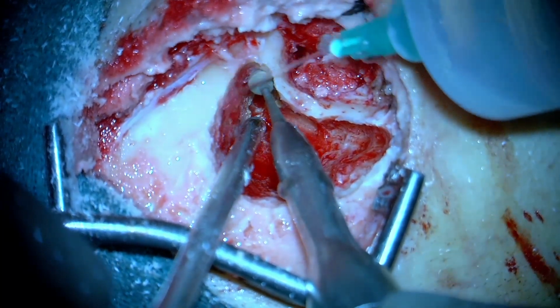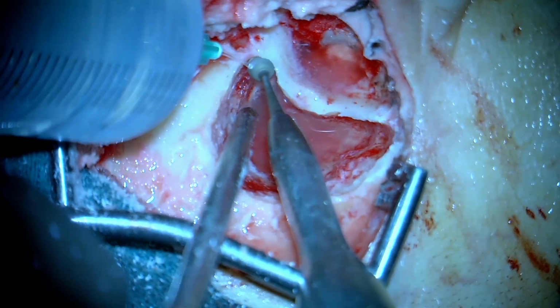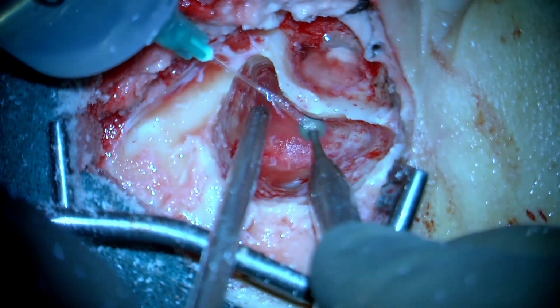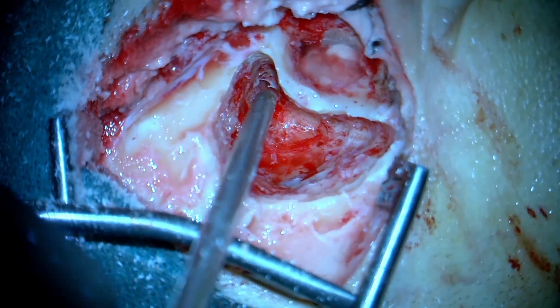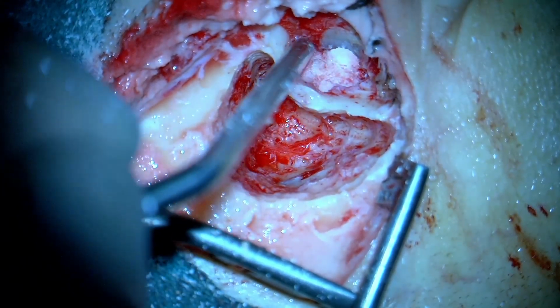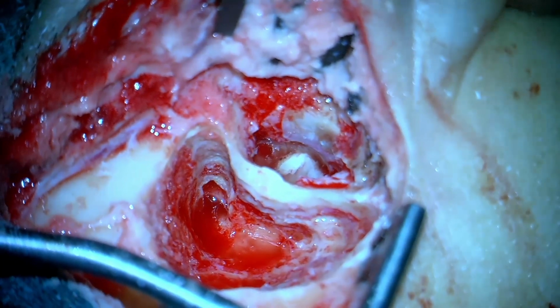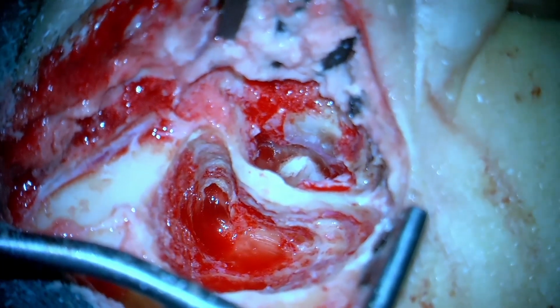Also, it's a good point to use a diamond burr close to the tegmen dura and the tegmen plate, because sometimes the cutting burr can injure the tegmen plate or sometimes the dura itself. It's also important to not excessively thin down the canal wall, because there is already a large defect in the canal wall, which we'll probably shortly see, and excessively thinning it may create complications in terms of reconstruction options.